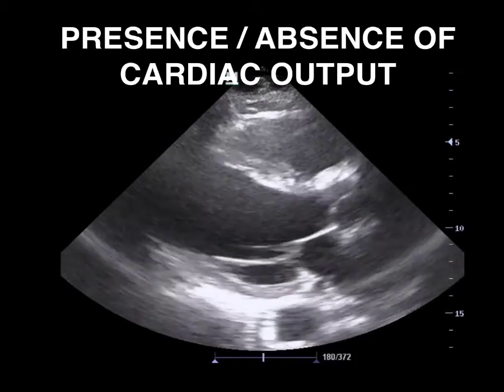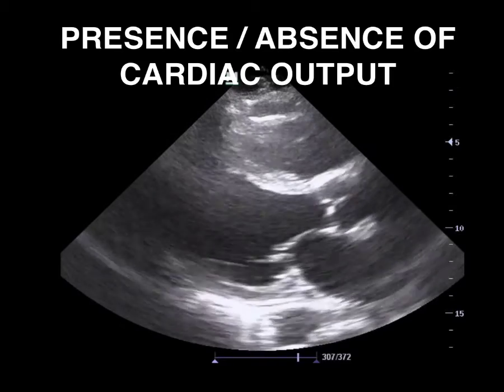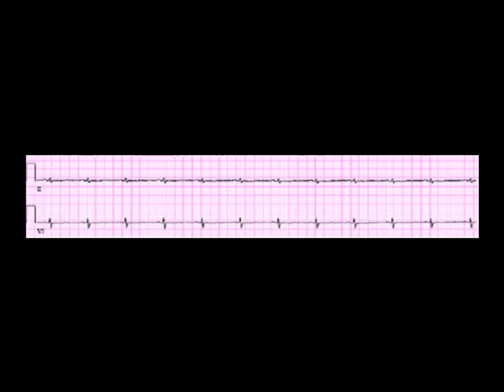Doesn't really look like what you would expect for someone with active chest compressions. Looking at the EMS rhythm strips, they all looked like this one, including the initial one when the CPR had been started in the field. So an arterial line was placed at that point at arrival and showed a blood pressure of 65/30.